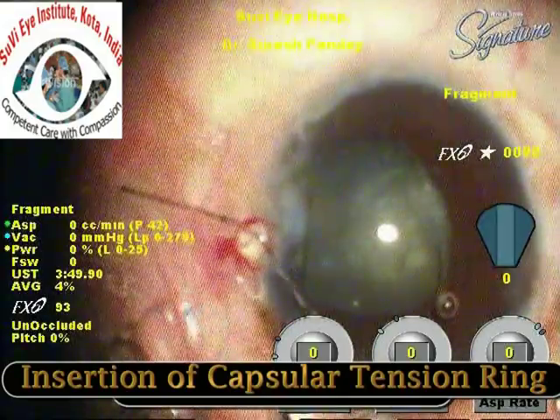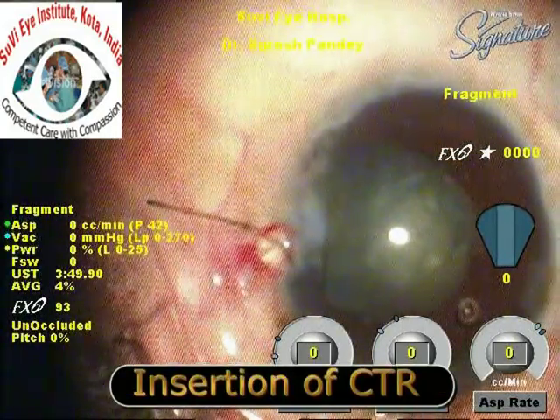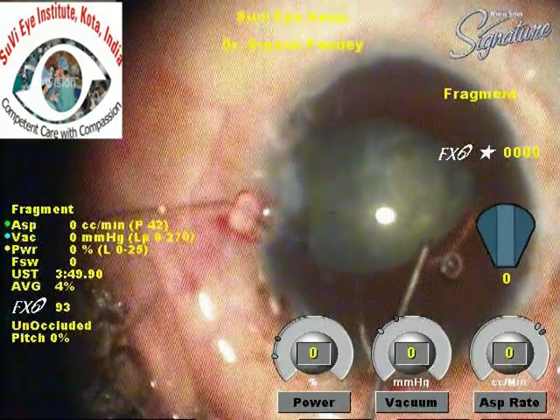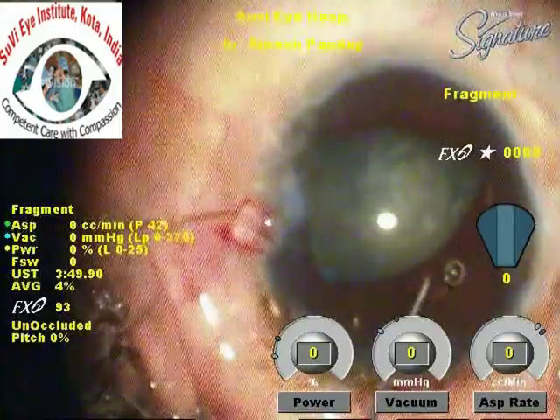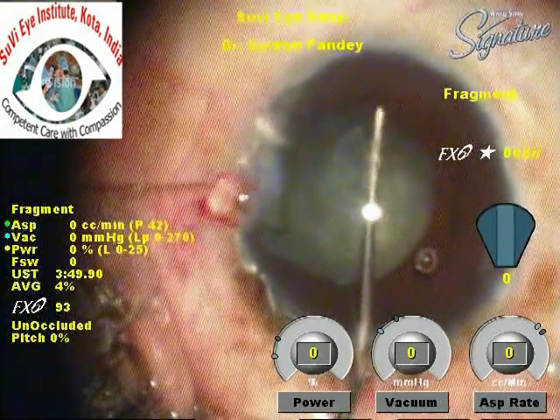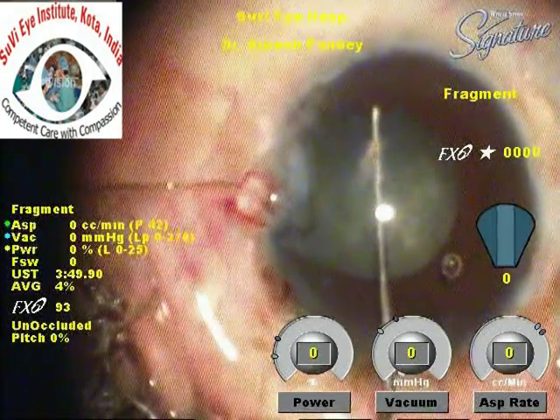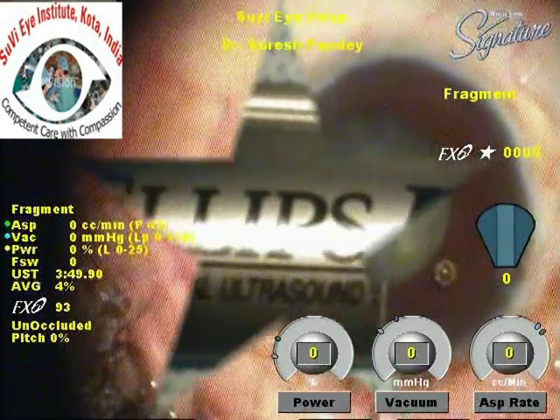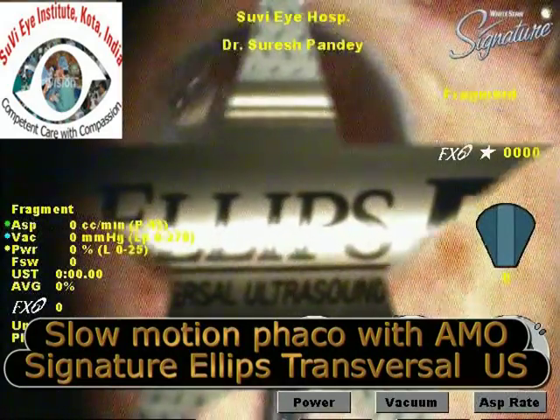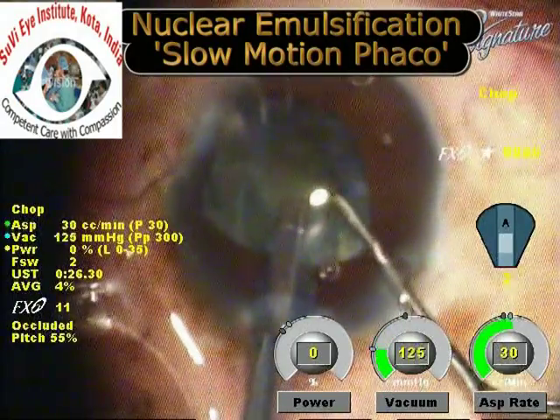After the capsular hook is placed, we insert a capsular tension ring. Different surgeons prefer to place the CTR at different times; here we are placing it before phacoemulsification to stabilize the bag during surgery. The contour of the CTR follows the capsular bag naturally and places itself well. It can be inserted using an injector or a forceps.